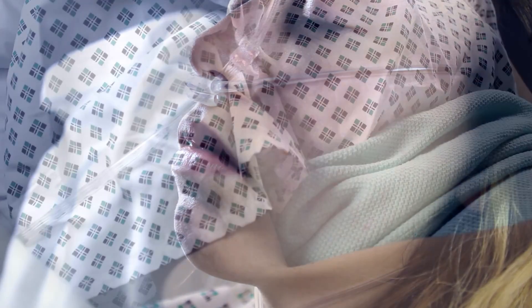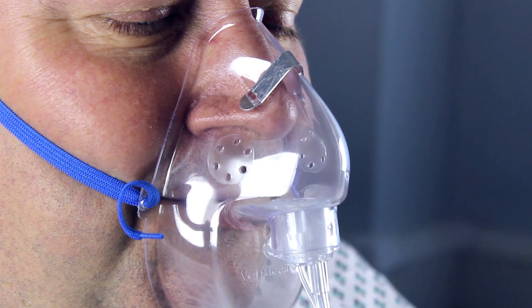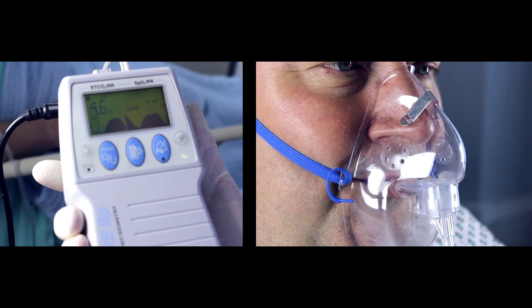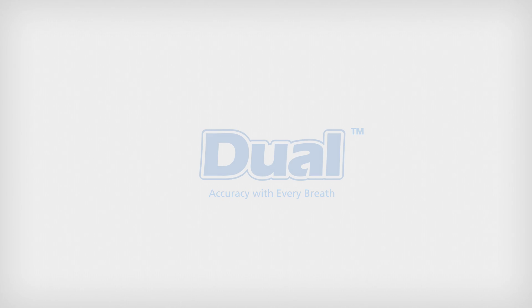Monitoring patients' breathing in emergency and critical situations is of paramount importance. By tracking the patient's expired CO2, clinicians can evaluate the ventilation condition of the patient during critical emergency situations and make the judgment to assess and treat the patient. Dual accuracy with every breath — to find out more, visit flexicare.com.